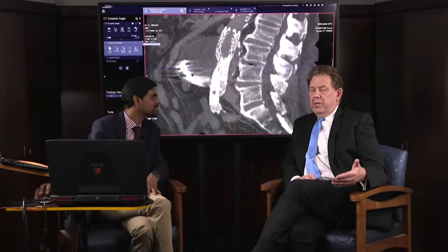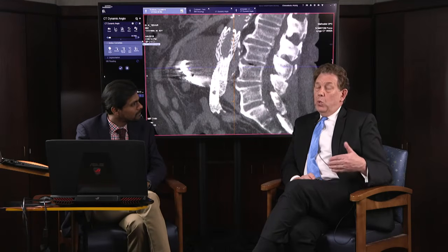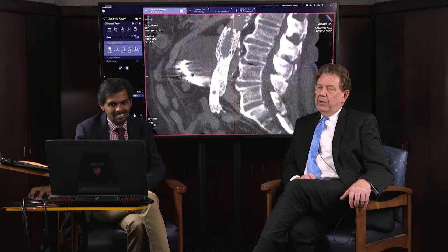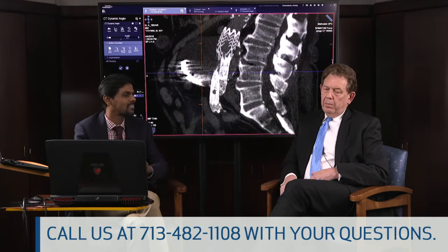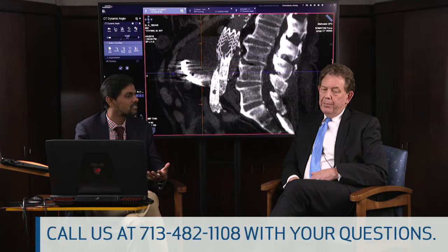Exactly. I don't know anything that would let you pick that up, in all honesty, even if you did an angiography. That's one reason we want to pack it while we're there, because it makes it very difficult to look at that particular area inside the aneurysm again. There are some metal artifact correction algorithms, but at the end of the day, it's basic physics. If the X-rays are absorbed by the coil mass, we can't recreate those photons that have been absorbed. We can try to guess by extrapolating, but it's not going to be a clean image.